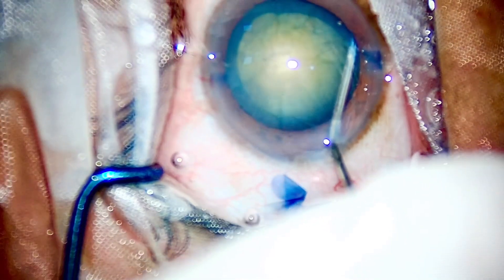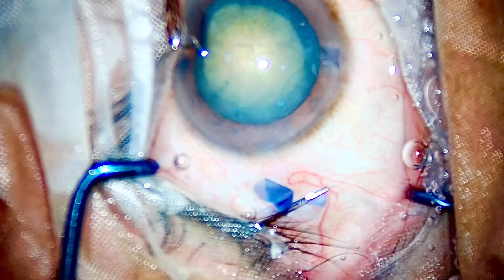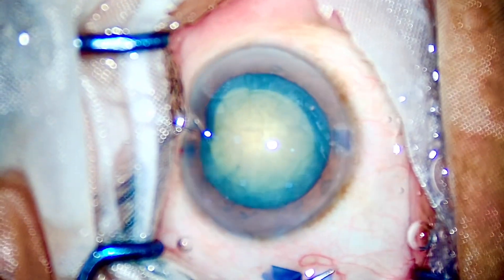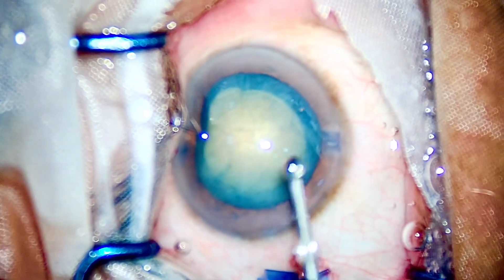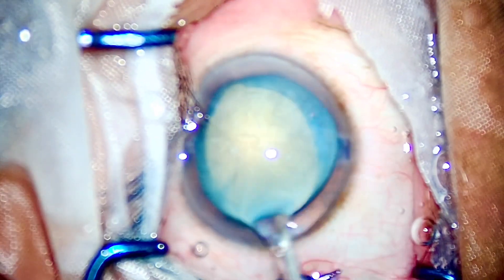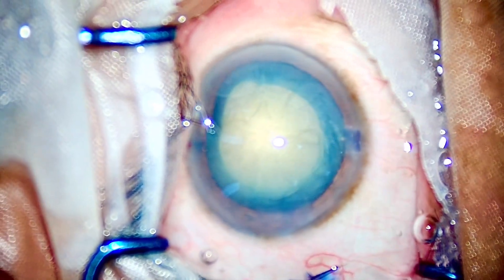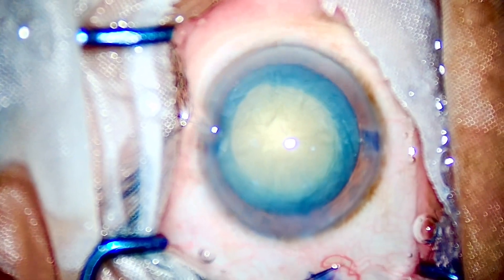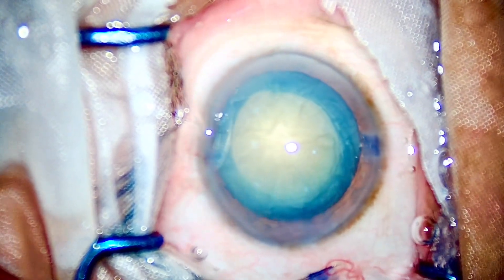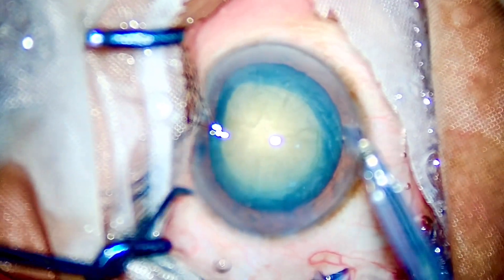Go deep, grab the endonucleus, find that sweet spot between phaco pedal 3 and phaco pedal 2, and once you have that sweet spot, just push your chopper down while the phaco is pulling the nucleus up. The phaco chop will be a breeze. It is the most important technique to master.